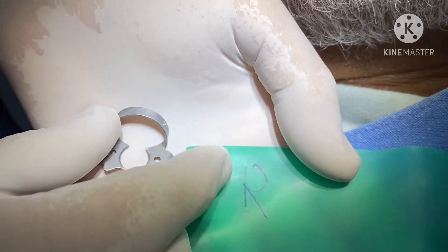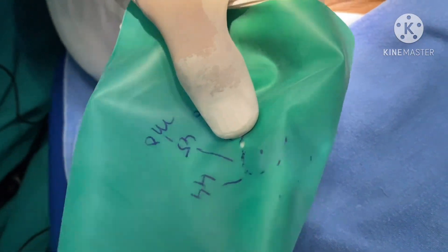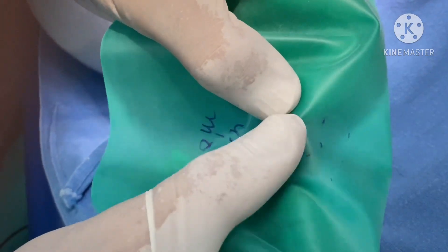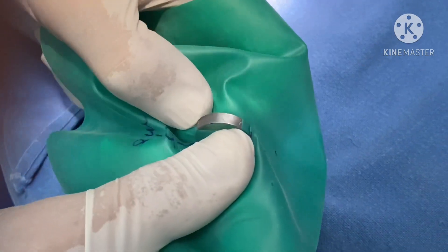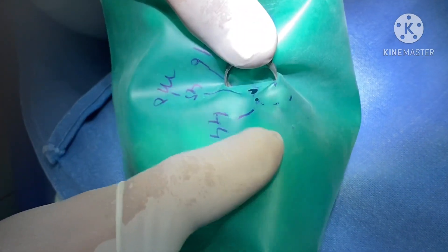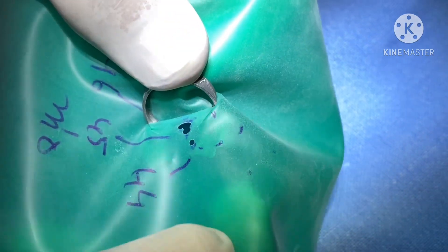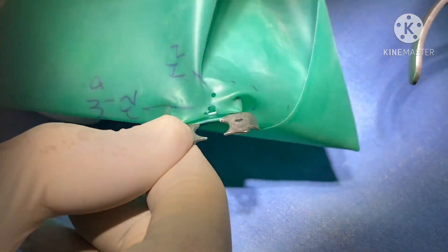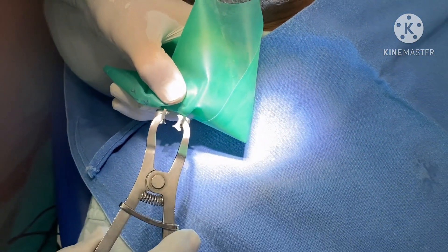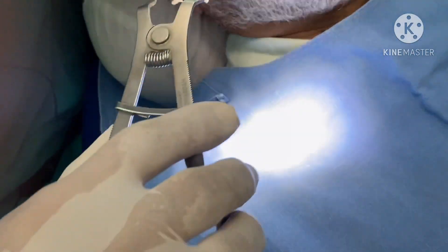No. 7 clamp — we take it below the rubber dam and slip it, firmly holding it in the center on the horizontal bar. Here we have done it. The two holes and the other holes should be in the center of the horizontal bar. Then we invert it and take the rubber dam forceps, put them into the eyes, and it is ready to be taken into the patient's mouth.